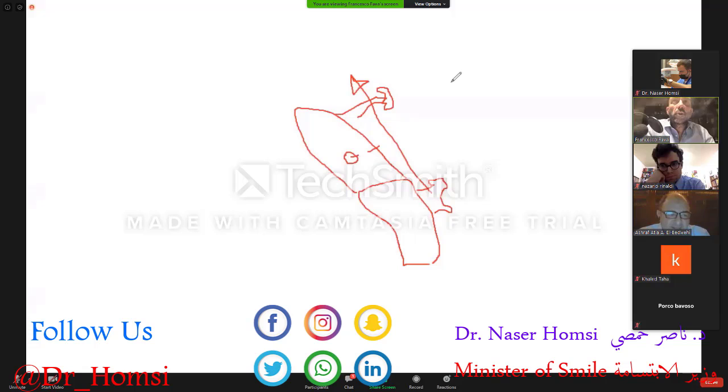But a good way to maintain the vertical position of the molar while performing an uprighting can be using the mini screw very low in order to prevent the extrusion of the molar.